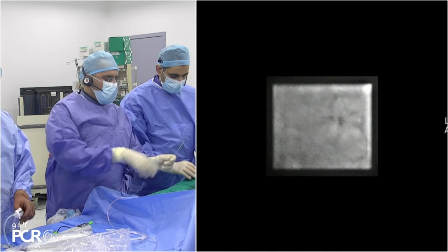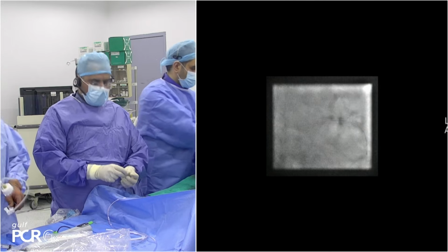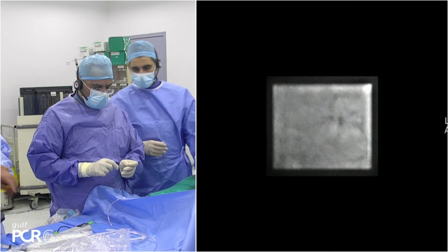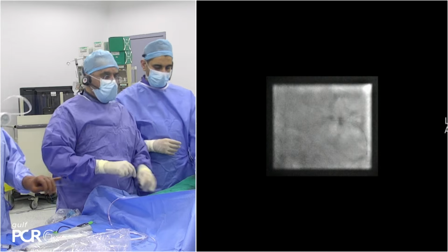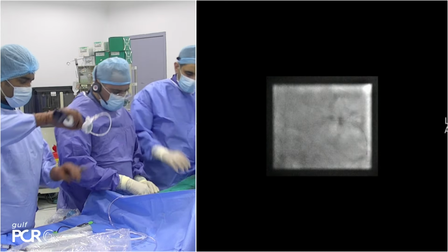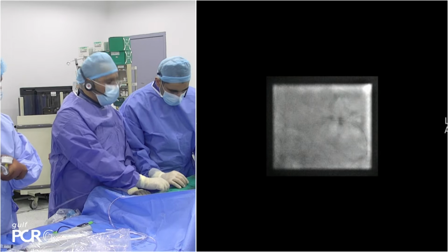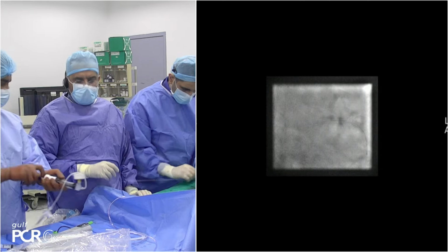Okay. But I think we'll have better than stent viz. We'll do the OCT. We'll optimize this part of the stent before we go. I guess you do give us the control angio after you get the OCT. You get both in. 2.5. Yeah, we'll do that.